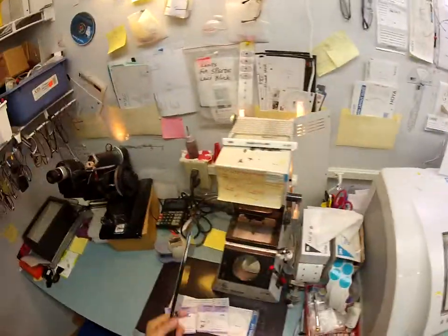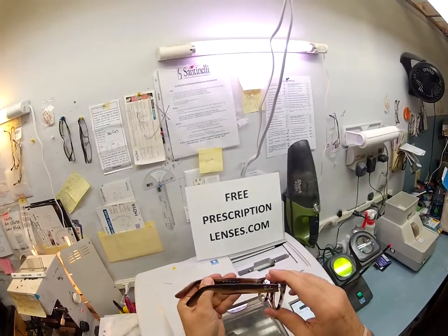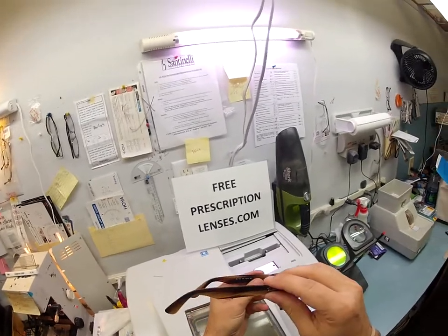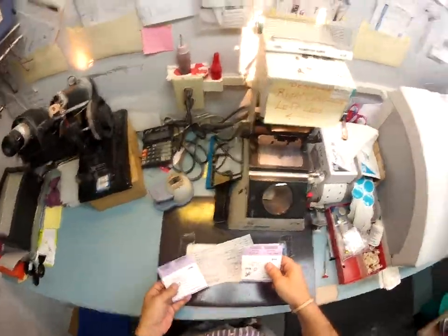I'm going to show you how I cut prescription lenses with anti-glare coating for your very own RayBan 5184 size 52. I will be demonstrating tonight on the 5139, which is the striped brown, but this should work for any color that you have. So let's go ahead and get started.